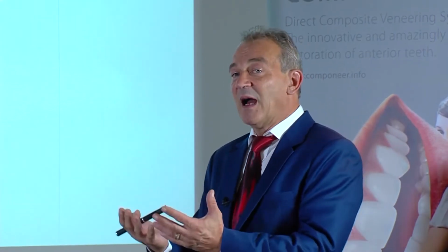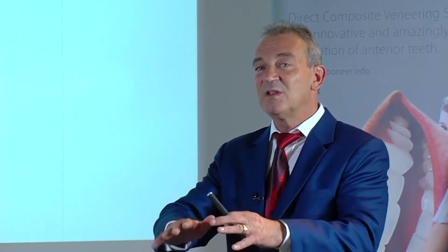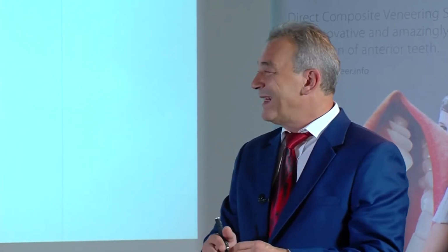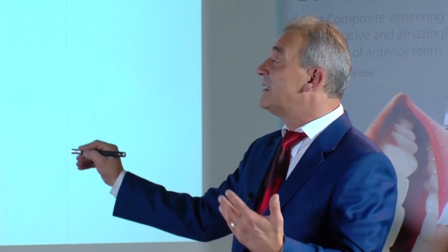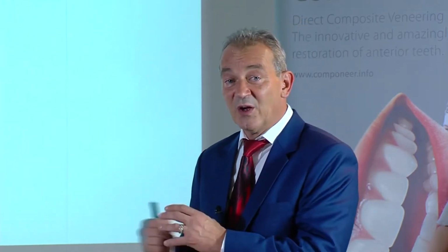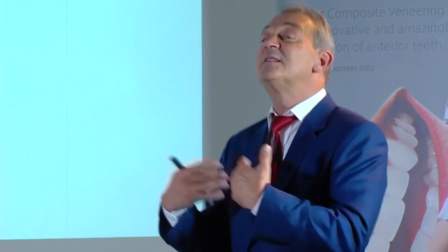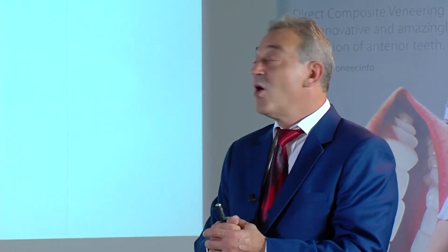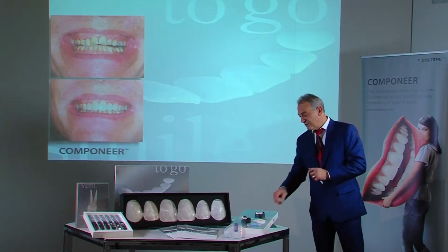As a rule, one uses composite material directly on the tooth, without conditioning it. This takes approximately 10 minutes. One applies the composite to the surface and can present the result to the patient immediately. The patient can see in which direction we could be going. And at the same time, I receive information. Is that right, what I suggested, and is it possible for me to deliver?